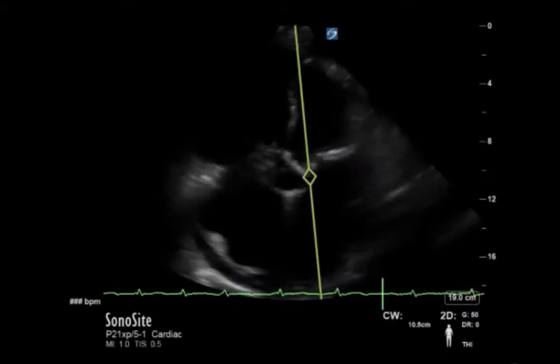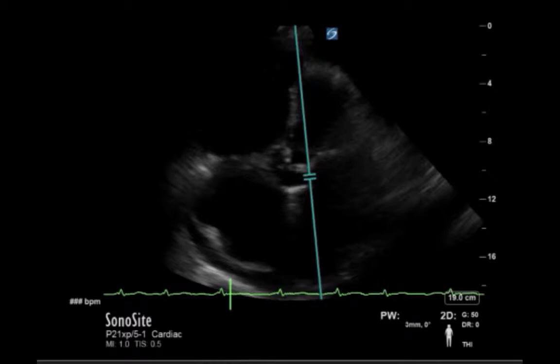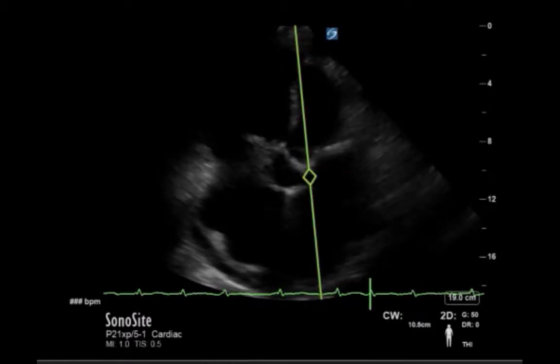Let's look at an example of pulse wave Doppler. So this is an apical 5-chamber view. And what I want to show you here is that, firstly, I can imagine the operator here is going to be looking for probably a sampling of a stroke volume.